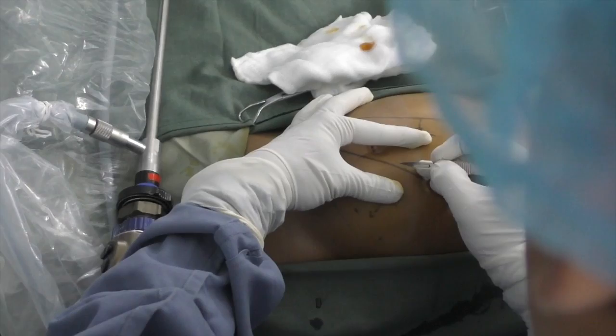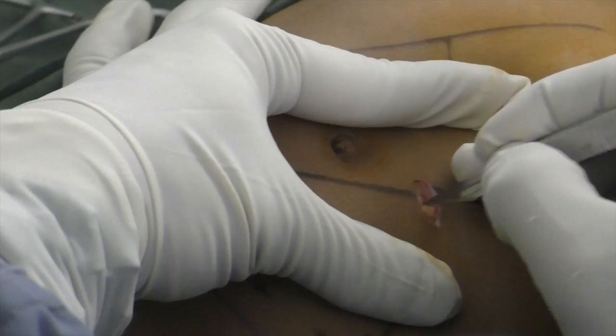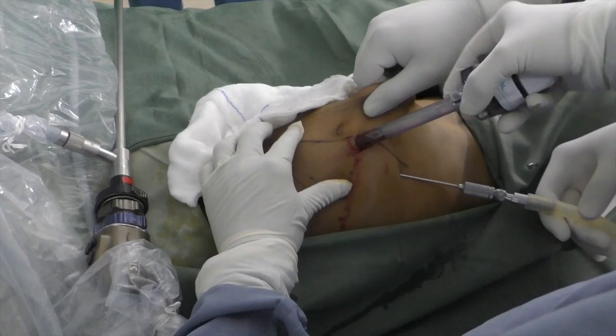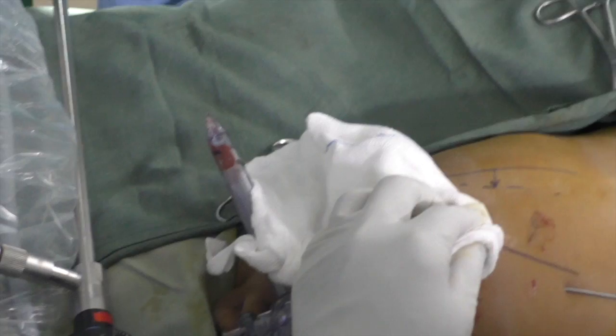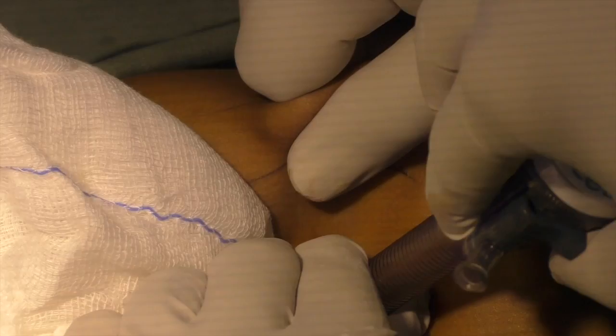Here you should be careful — overconfidently going the blade into the abdomen is dangerous. Always give a bigger incision than the port size and cut the rectus sheath a little bit; a nick is acceptable. In children, the left hand is the brake and the right hand does the rotation, with one person lifting. Children have a very tough rectus sheath, so always give a good nick in the rectus sheath. Immediately it will go easily — and see, it has gone easily.